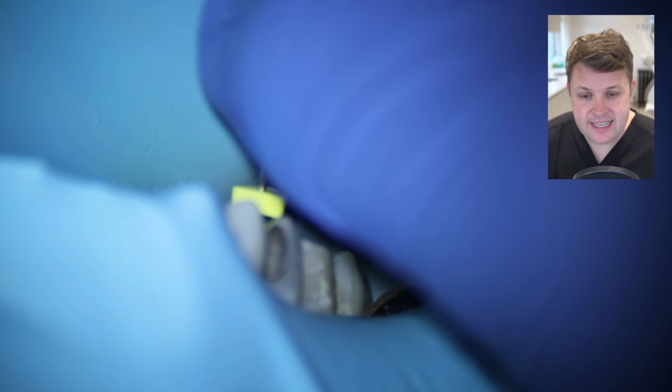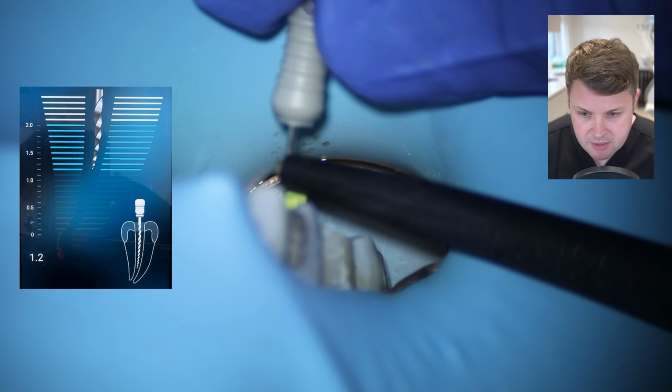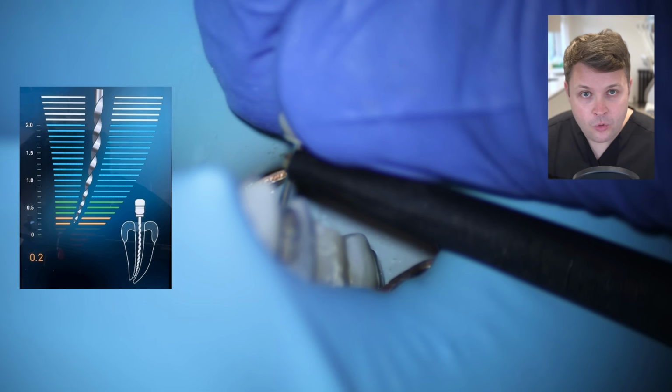Then when we get a size 8 D-finder and hook this up to our apex locator, I can see that we are starting to negotiate down. When we hook this up to the apex locator, we're kind of close, not too close. Then we do a little bit of watch winding, and this is now reaching down.